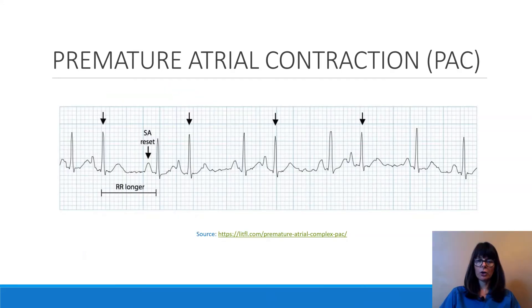Here's another look at this rhythm strip, a bit bigger. You can see they also point out that the R-to-R interval is longer here. When looking at regularity with calipers or EKG paper marching — as covered in my other video — you can basically with the naked eye already see that the beats occur at different intervals and are irregular.